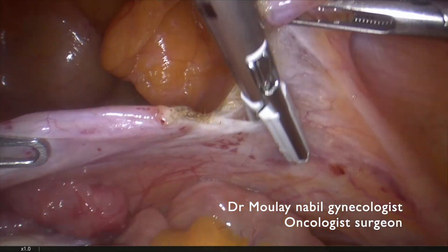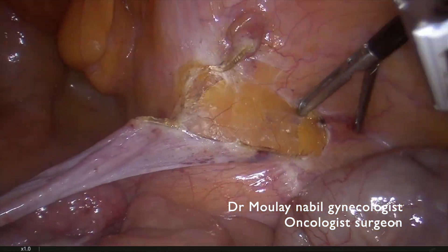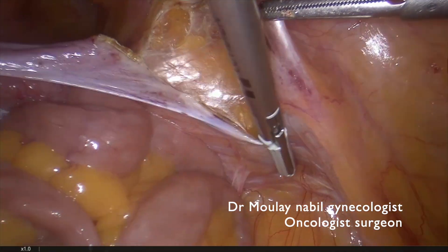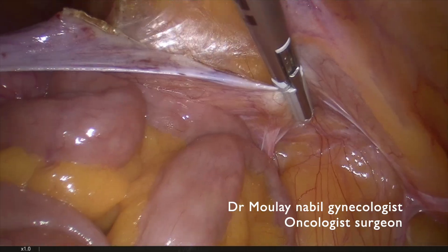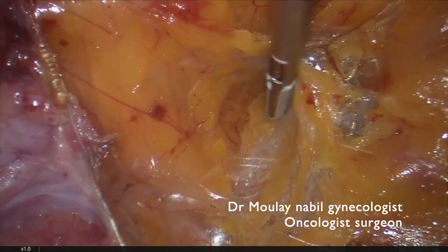We began the surgery by cutting the right round ligament and we opened the peritoneum lateral to the IP ligament to begin the pelvic lymphadenectomy.